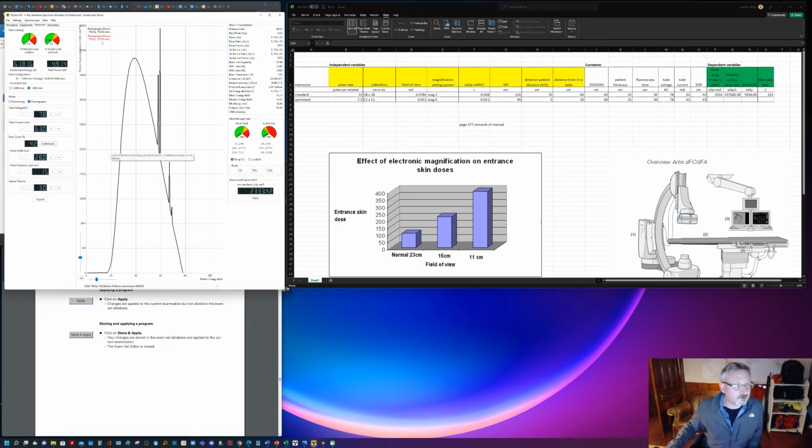So that was a total of 793.8 mAs. Let's put that in as an mAs, total tube charge in mAs, and that was 793.8. Okay, we'll add that extra dependent variable there.